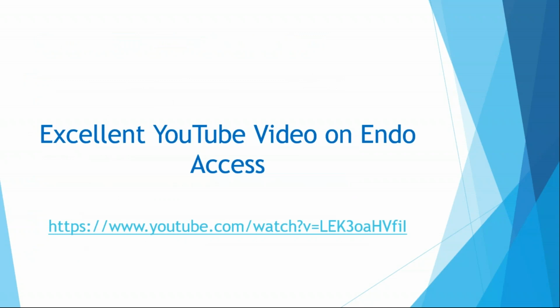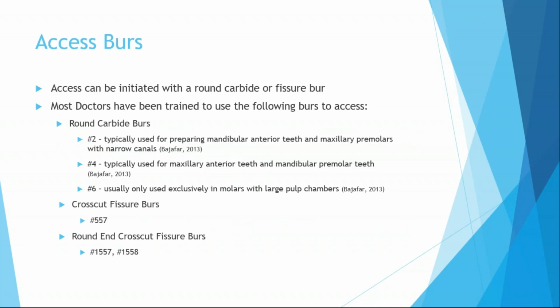So this is a little bit longer of a video. Afterwards, if you guys want to really get in deep with the endo access, it's about an 8-minute video, so I'm not going to play it, but it's a really good resource, and it has a lot of different terminology that you can use when referencing access points.